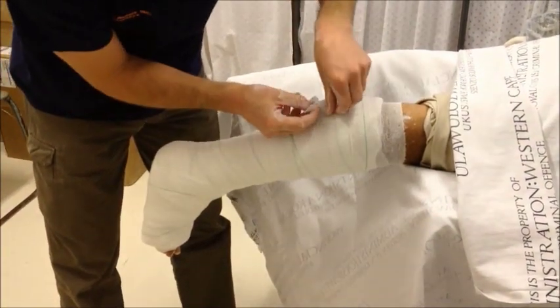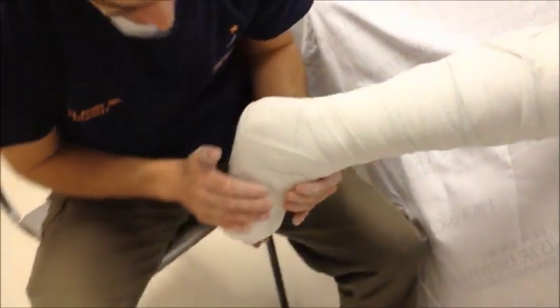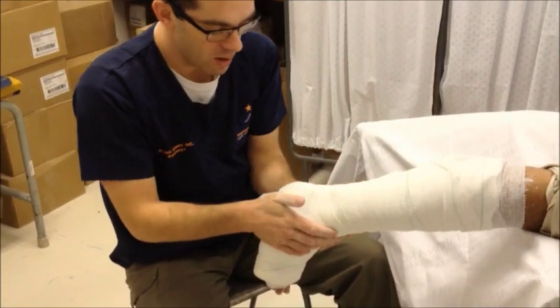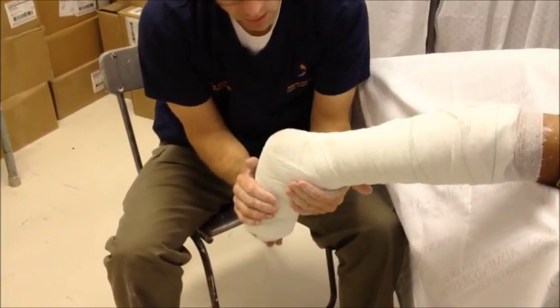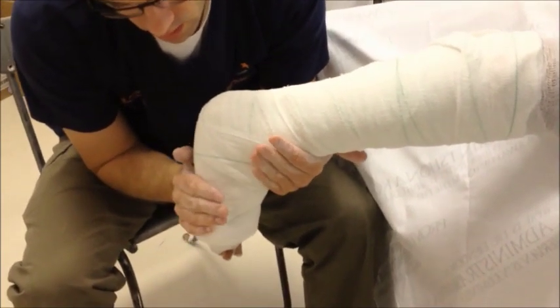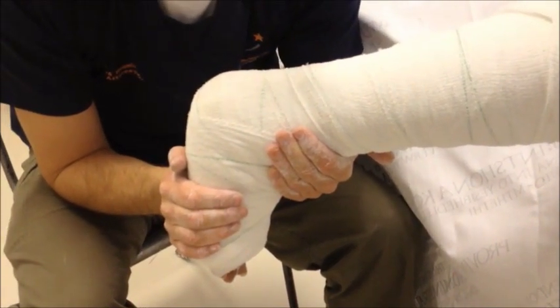Usually now you'll be doing a final mold and manipulation so you don't have time to stick this down nicely — just tuck it, you'll get back to that later. This is the time, if you have a chair or whatever you need, to make sure that you are molded on the sides of the Achilles tendon without causing pressure. Be nice and gentle and molded. Please note — I'm using my palms, never using fingers or points. We would now do our final positioning, gently, to about 90 degrees and neutral on the lateral in terms of supination and pronation. Then just wait for this to set.